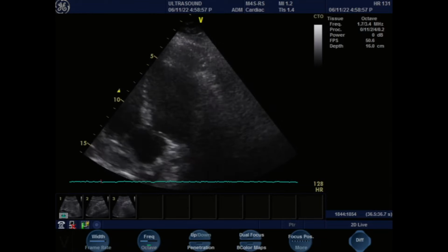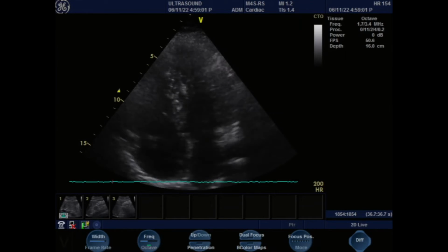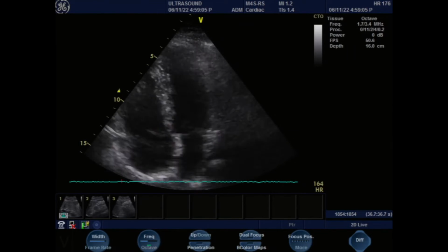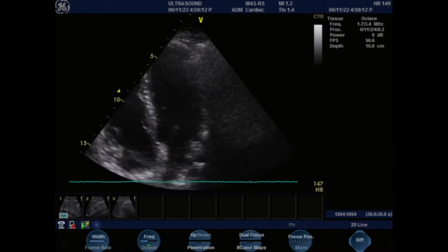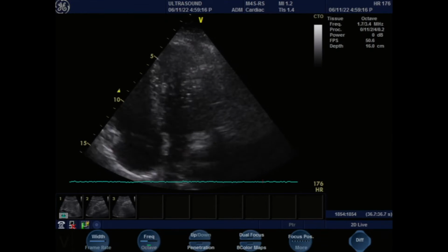And here we get a better image. So you can see the right ventricle is coming into view. See there? It's the right ventricle here. Upside down, right atrium over here. This is a tricuspid valve right there. Yeah? This is the mitral valve, which is again very good. See it opening, closing? So you don't have to be a cardiologist to know this is actually a normal looking mitral valve. You can see how widely it opens and closes.